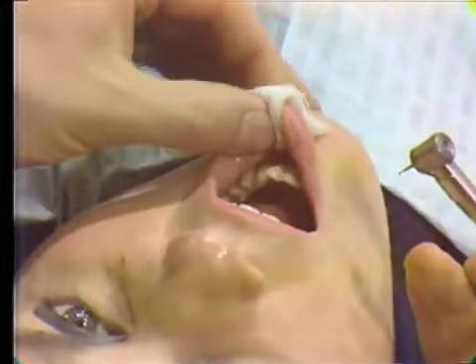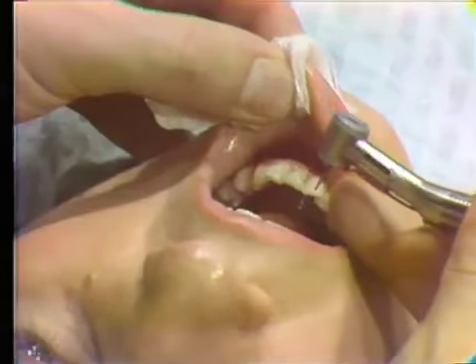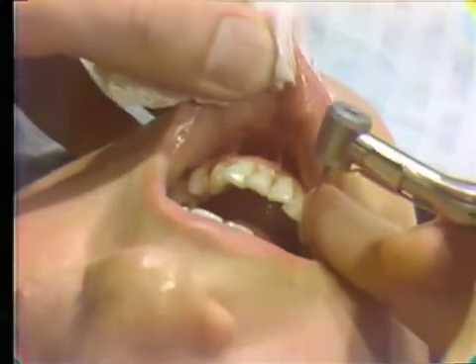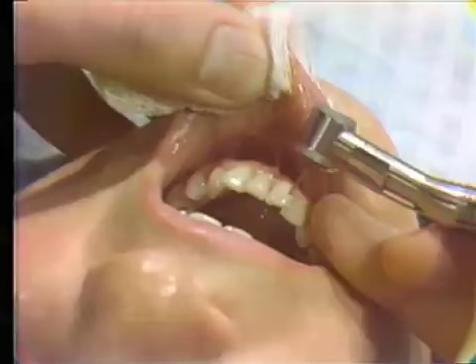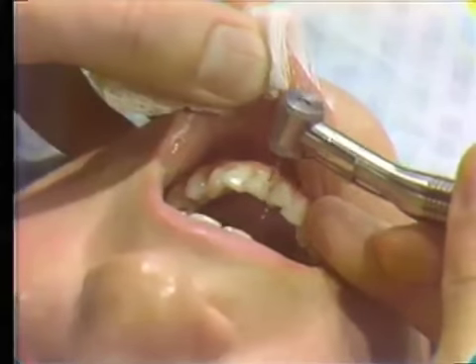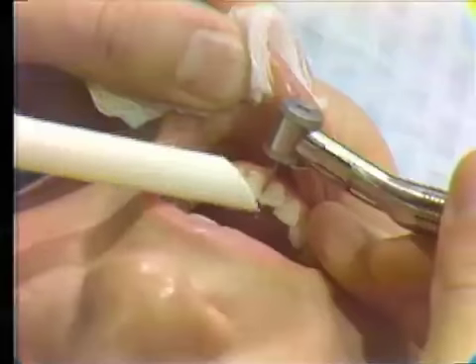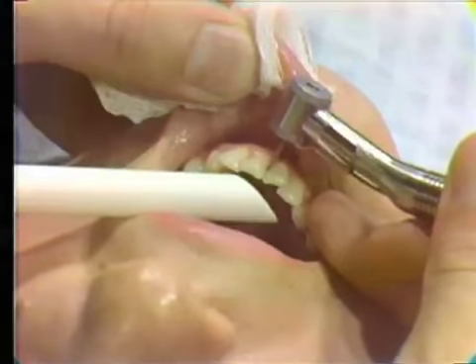The lower lip can be retracted by the operator with the thumb and index finger of the left hand. A 2x2 gauze is used to add control when the lip is grasped. Finger rests can be established on the facial surfaces of the mandibular right cuspid or premolar teeth, depending on the operative site. The evacuator tip is placed lingual to the tooth being treated with one half of the opening above the incisal edge.